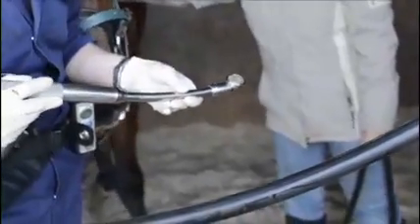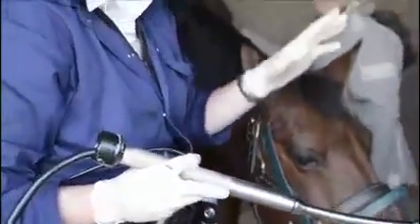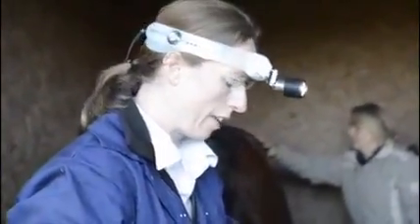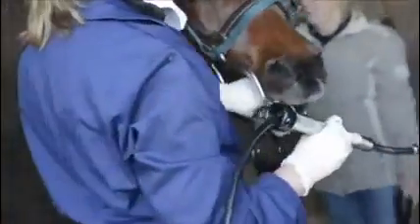So this is the different, still the battery powered motorised instrument, but it's on a curve with a flexi disc that turns. So if we turn this on, see what the horse thinks of it. And it spins around as a disc, so it takes up material and it gives us a nice smooth even run along the upper arcade to look at his upper cheek teeth and to try and make sure that we can take off any points that might be digging into his gums on the outside of the upper teeth. So a slightly different shape to our last one.